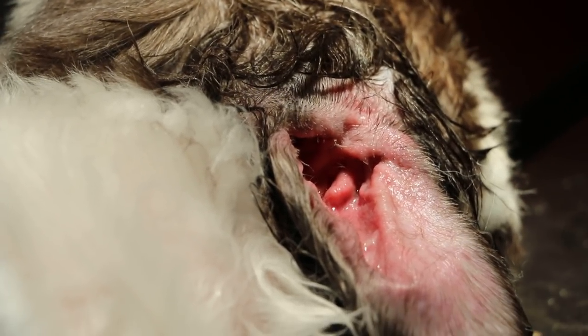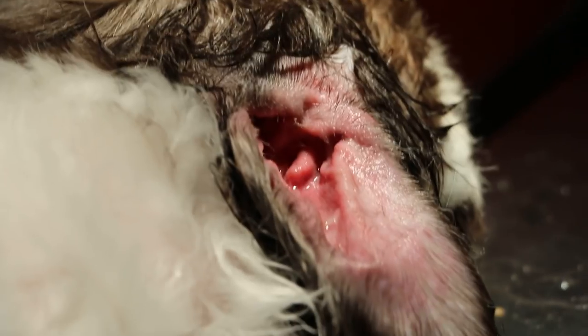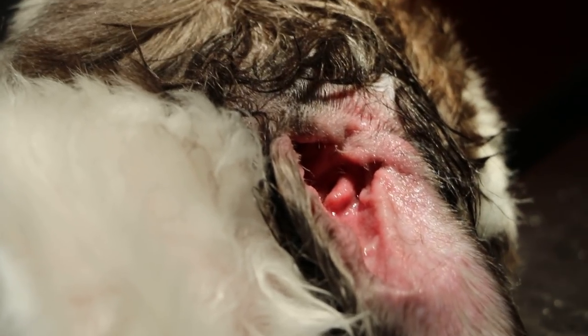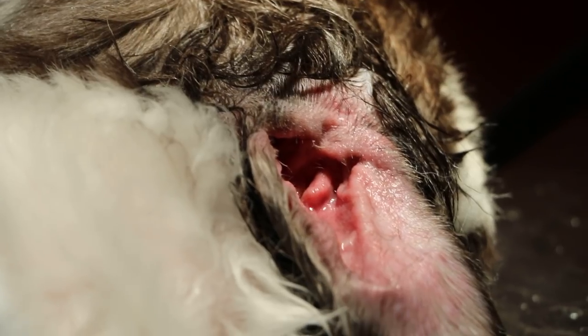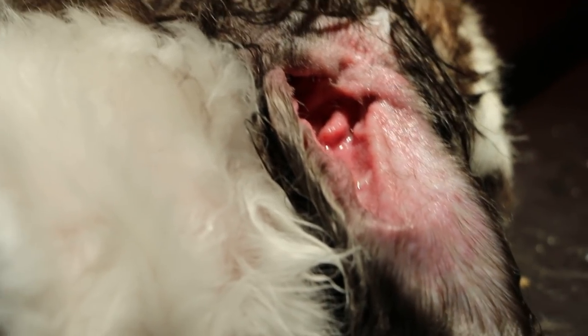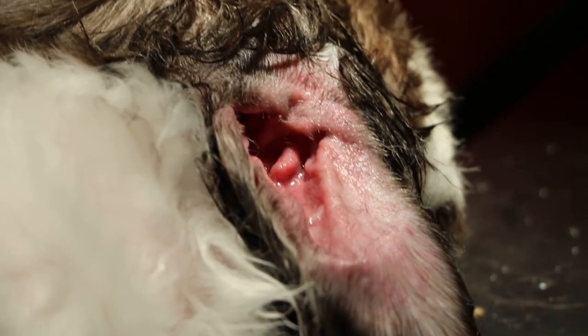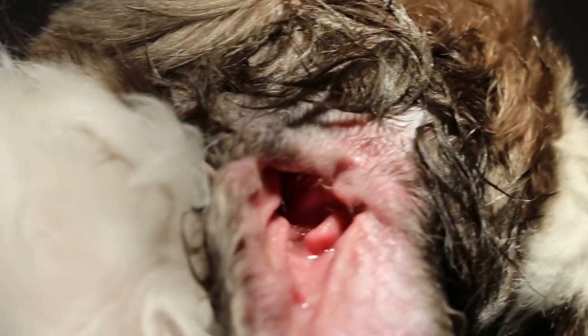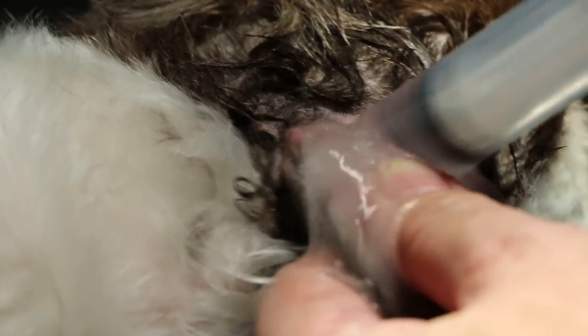The other side we don't really need to do because there's no complaint from that side. So I will do more on the left ear — one more time. The dirt is normally in the middle ear, which is hard to access.